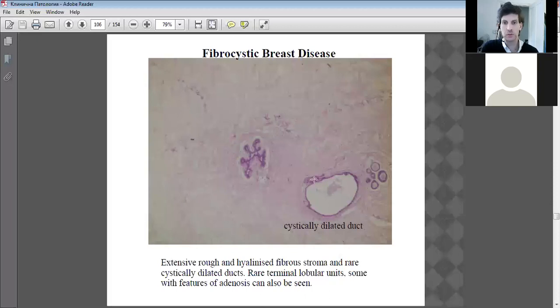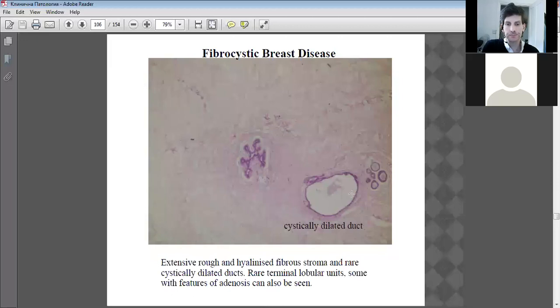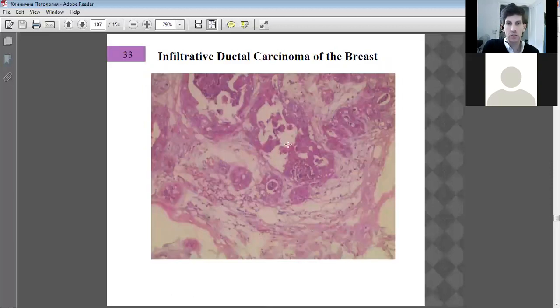associated, as we've seen before in a previous slide. Lobular units all over, fairly uniform border. However, the pressure creates a lump in the breast, if you like. Infiltrated ductal carcinoma. So as I said before, this fluid-filled duct can, in this layer, become carcinogenic. Carcinoma of the breast is evident here because of the examples of necrosis. Now here we have a good example of necrosis forming.